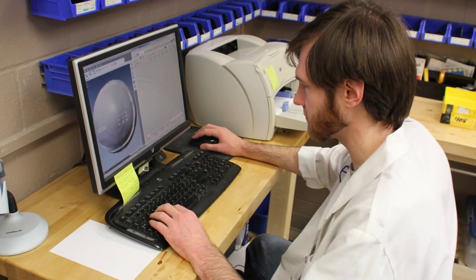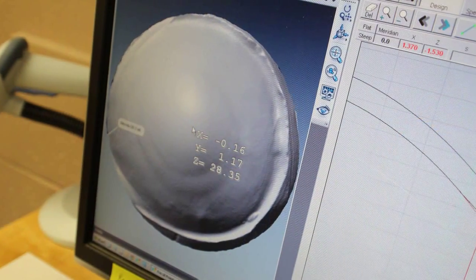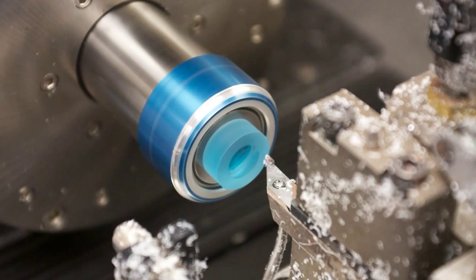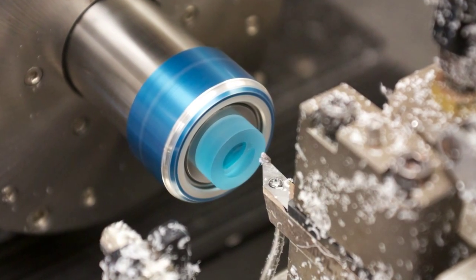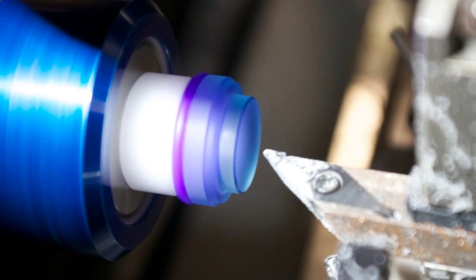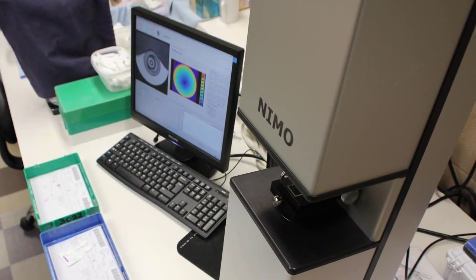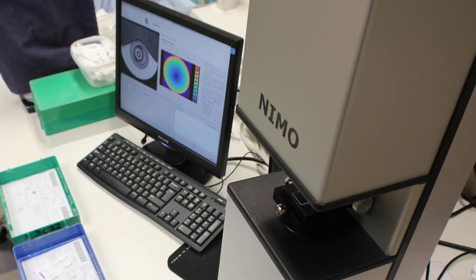The iPrint Prosthetic is created using the latest technology in 3D scanning and proprietary software. The computer-controlled machining system creates an exact match to your individual eye, providing exceptional comfort and vision. With the iPrint Prosthetic, your custom vision is in sight.